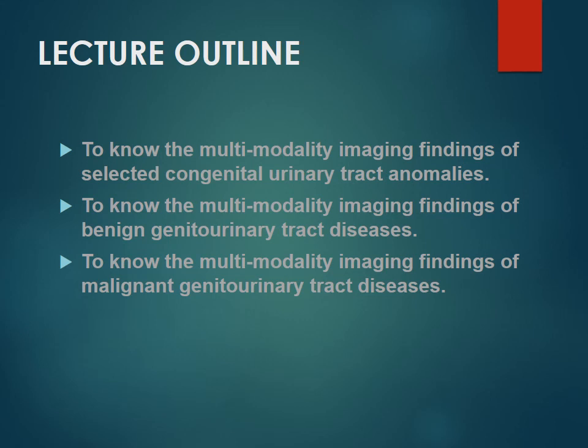So we have tackled the multimodality imaging findings for selected congenital urinary tract anomalies, benign and malignant GUT diseases.